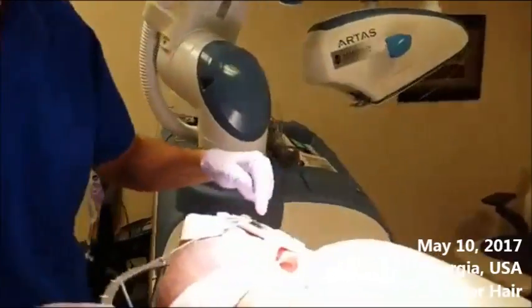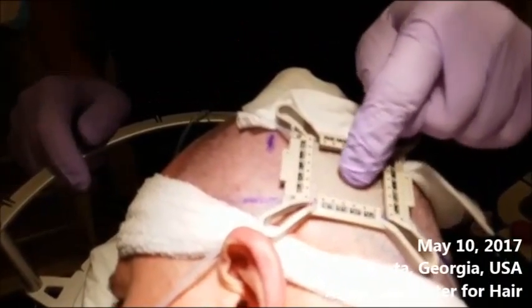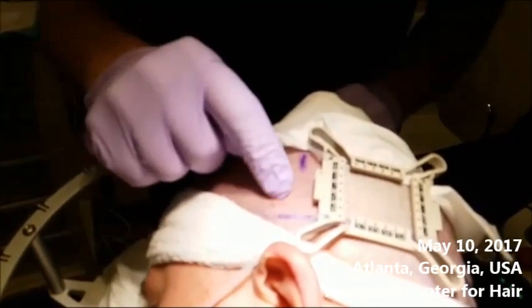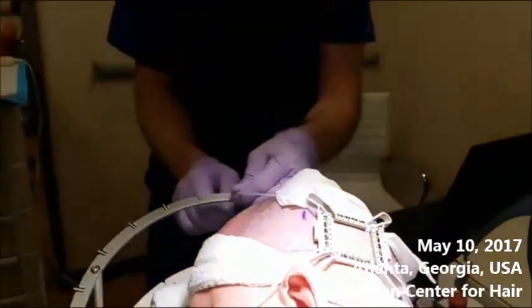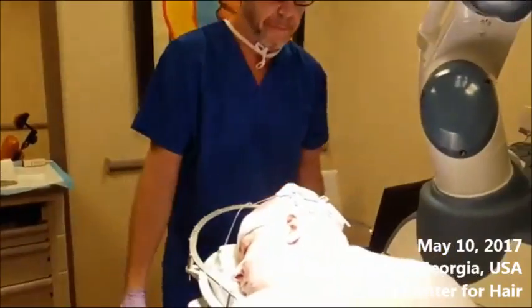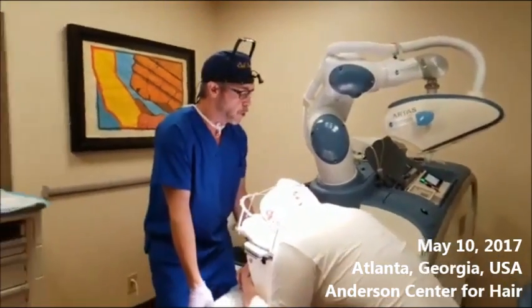You can have a look in here and see that the skin inside the box is blanched and doesn't compress when I touch it. The skin over here is kind of pink and blanches a little bit white when I touch it — it's under much less tension. We're pretty much set here to get going. I'm going to make a couple of adjustments and then move the chair in. We're going to start slow, Charles — I'm going to do one or two grafts just to make sure that you don't feel it.